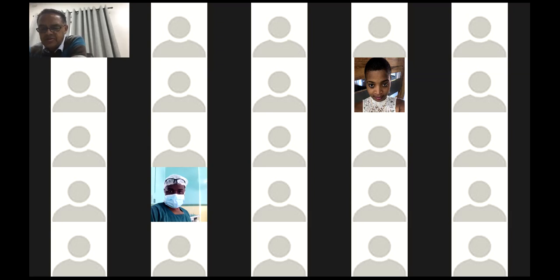The new uncemented implants with the more sophisticated bearings, such as ceramic or ceramicized metal, which is what I use, Oxinium. These patients are giving results of hip survivorship of between 20 and 30 years. So the need to complicate things further by doing femoral osteotomies and acetabular osteotomies is reduced.